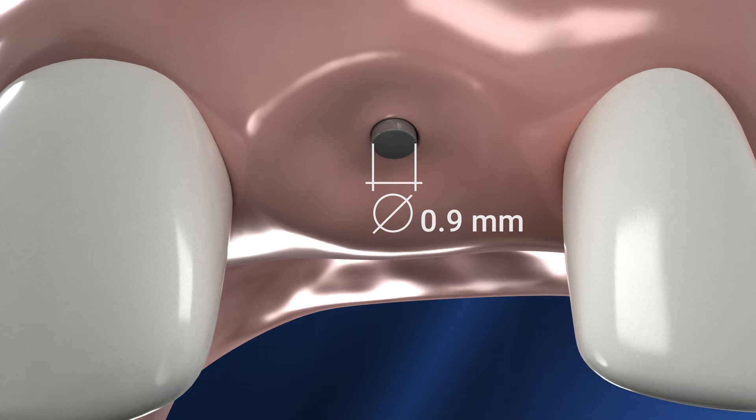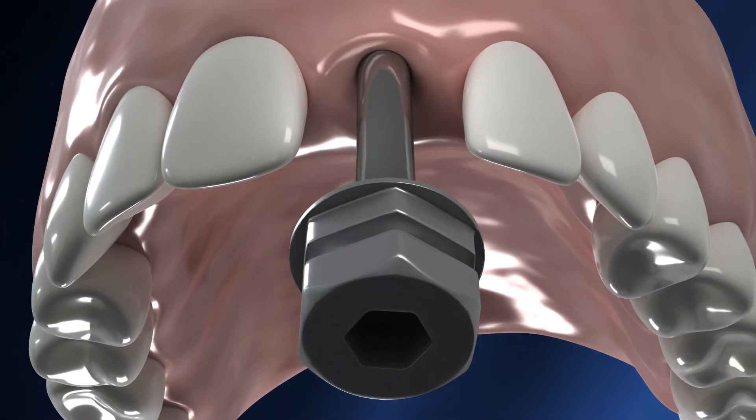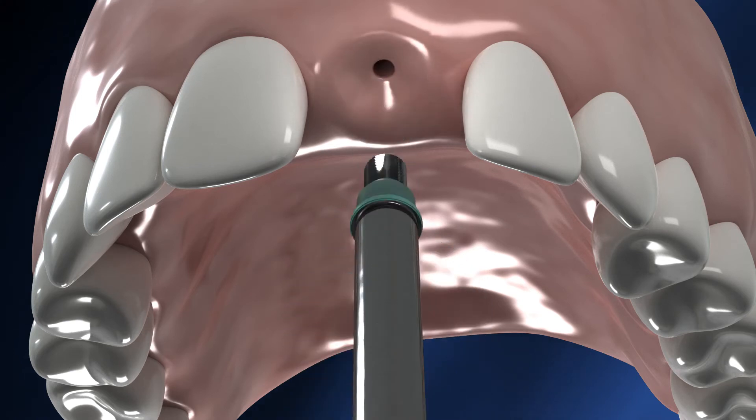Instead of using a punch, use the Pathfinder driver to unscrew the Pathfinder from the implant, and gently remove it through the gingiva.